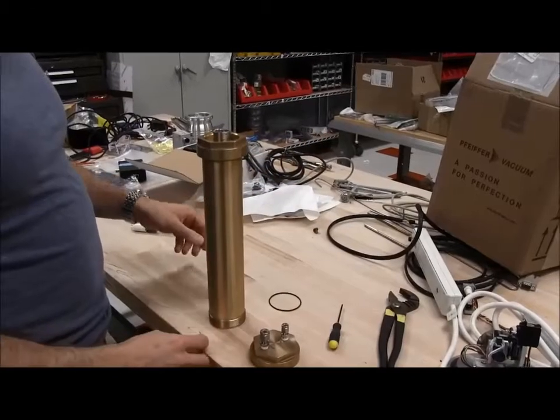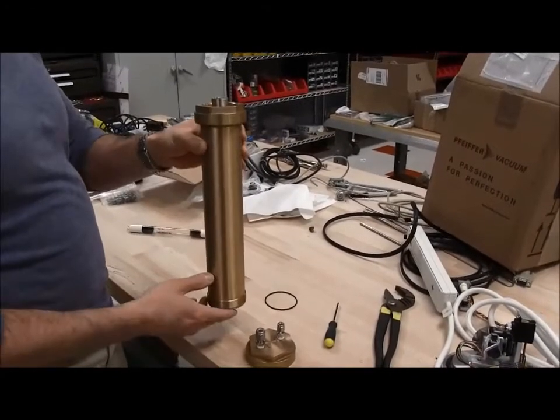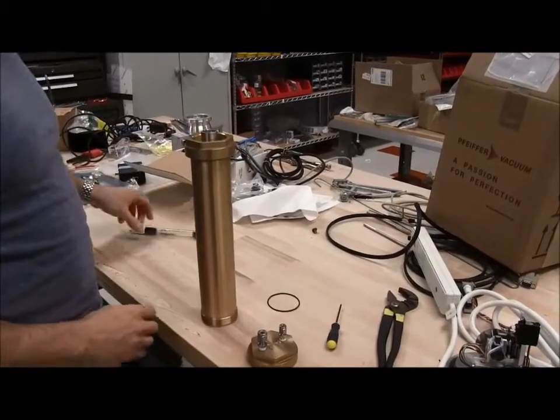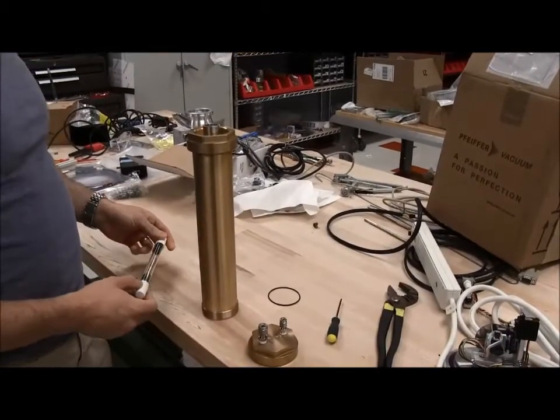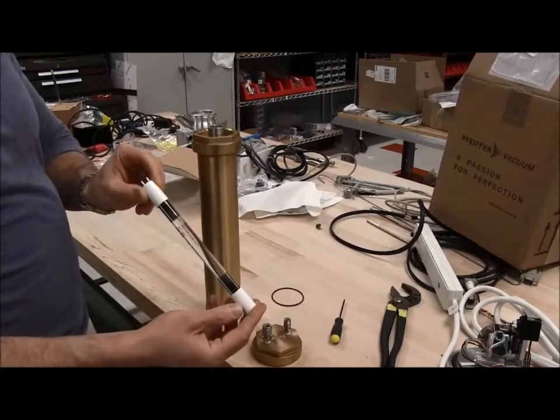So I'm going to demonstrate how to replace the UV lamp inside of the ozone chamber, as part of the clam chamber, and typically when an ozone lamp goes, it'll look like this on the inside.